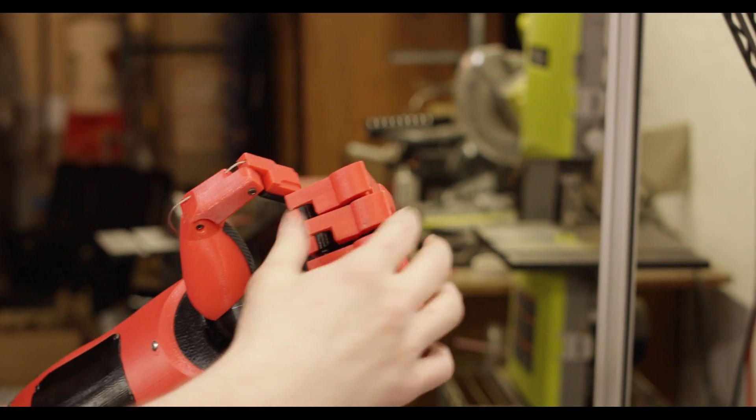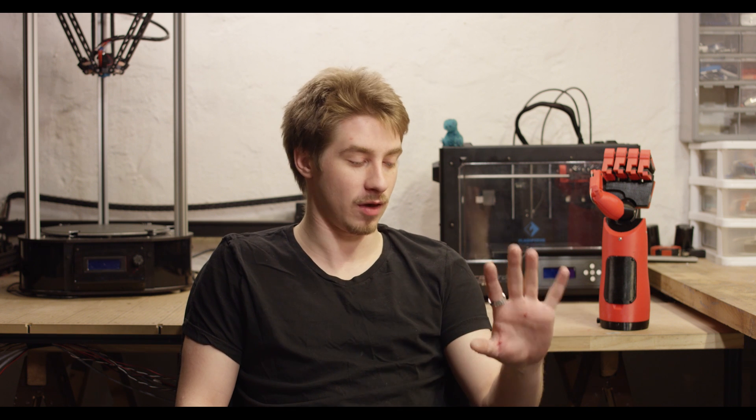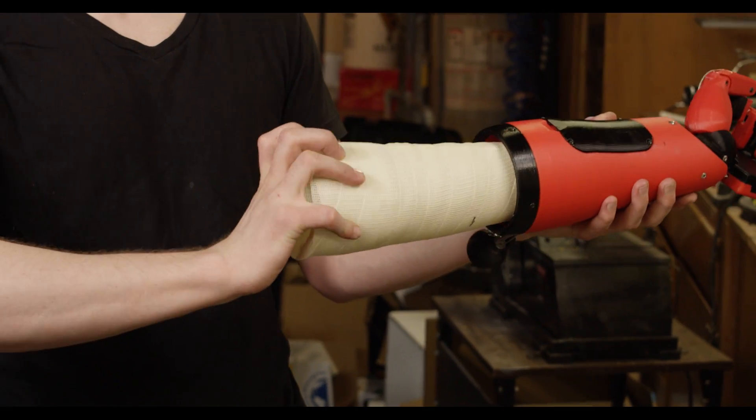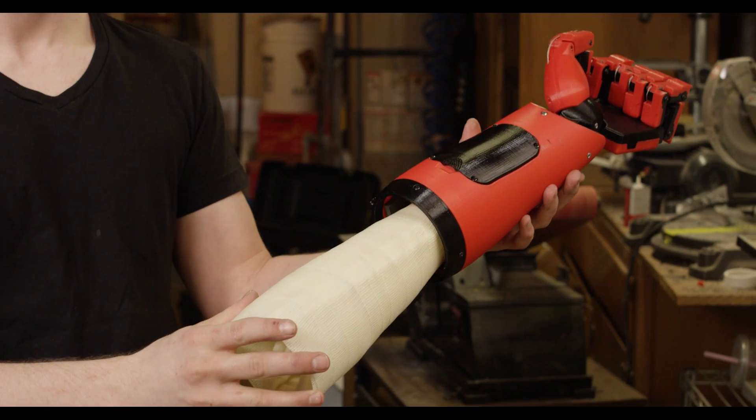I decided that it should automatically be closed at rest and should just require user input in order to open and then be placed around an object and grasp it. Once I was happy with these initial finger prototypes I started working on the actual hand itself, and to facilitate that my client sent me a casting of what was left of his arm so I had something to work off of and I knew the scale would be correct.